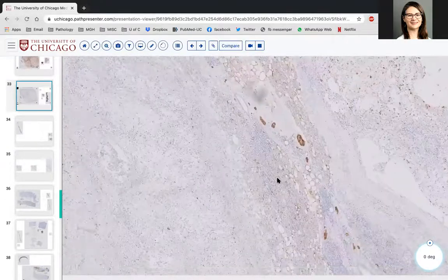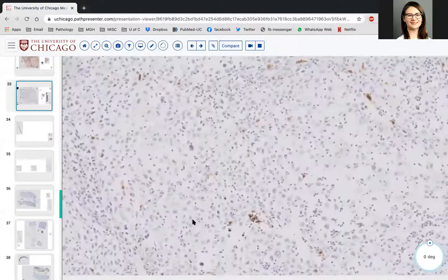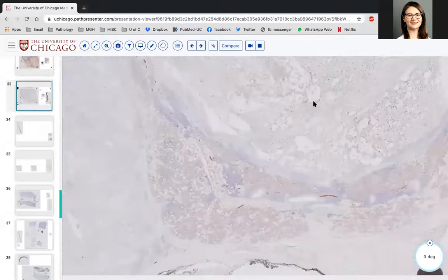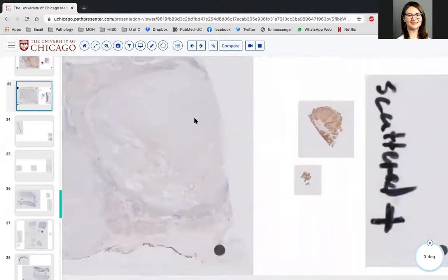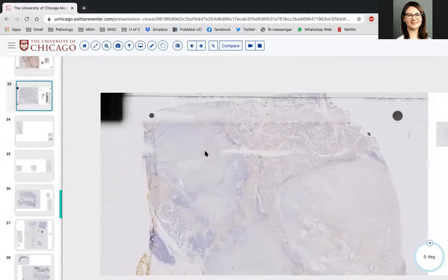So when I'm trying to diagnose a myoepithelial carcinoma, I always use a number of immunostains, because you never know which one you're going to get to be positive in that tumor, if that helps. That's why these are tricky. They're sneaky.